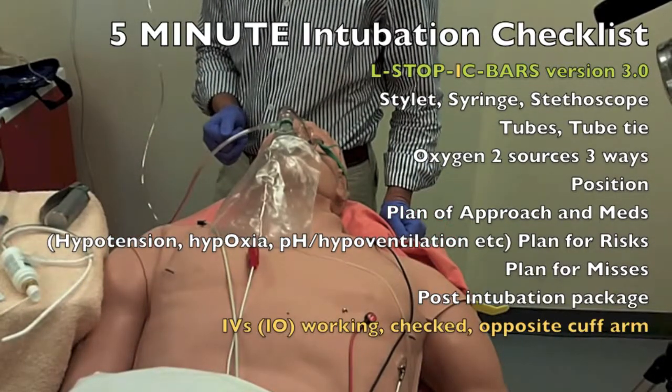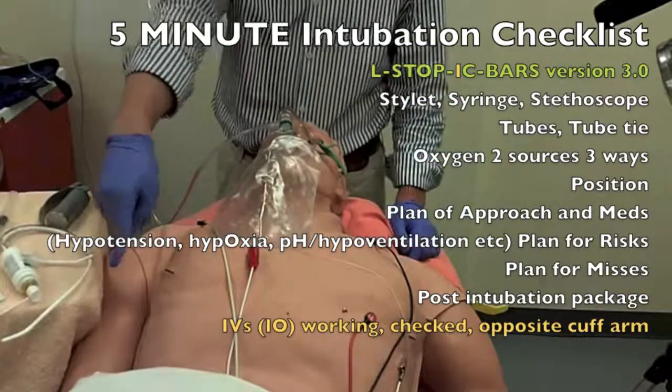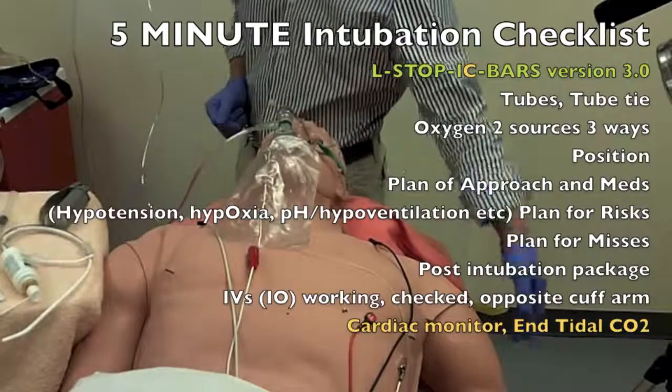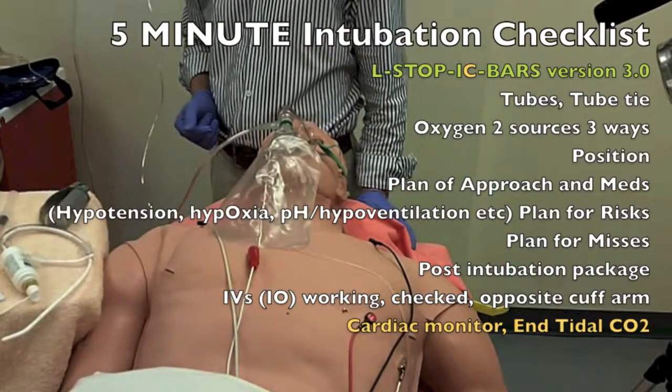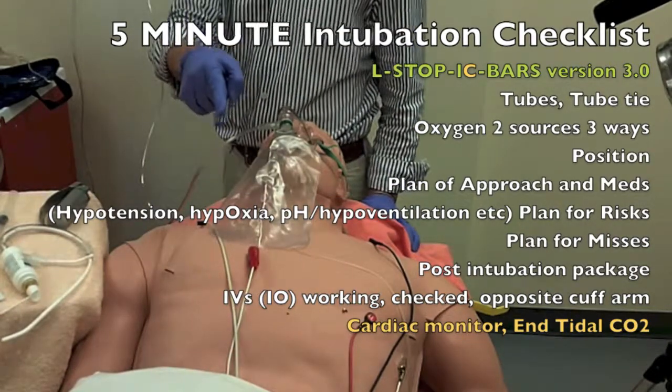Okay, IVs. What do we have for IVs? We've got two IVs going there. We've checked them, and they're working well. We're going to use the one that's opposite the cuff arm. So we've got the cuff on. We've got the IVs running well. We know which is the drug arm. End-tidal CO2 is ready to go. Yeah, ready to go. Check.